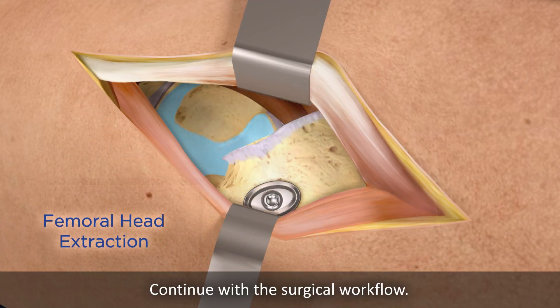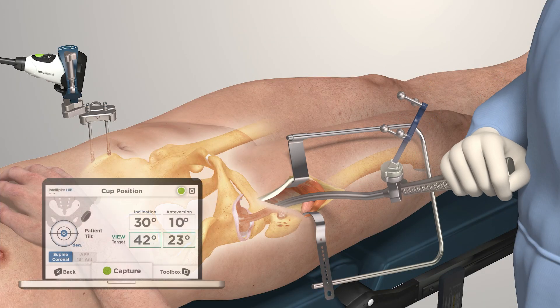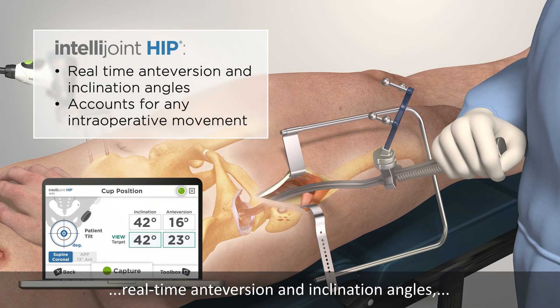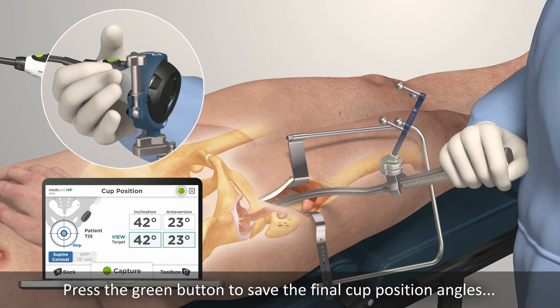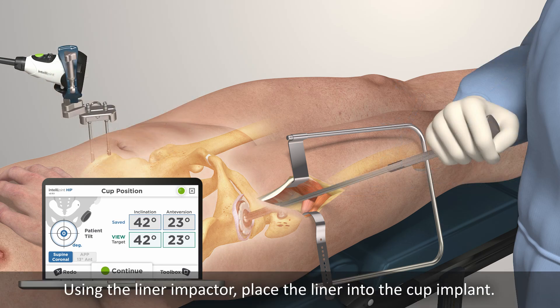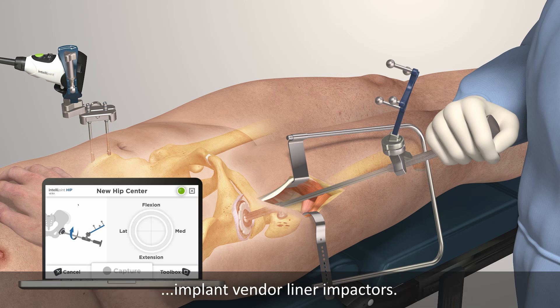Continue with the surgical workflow. The tracker can be easily attached to all traditional implant vendor impactors via a magnetic mount. Position the cup as desired. IntelliJoint Hip provides accurate real-time anteversion and inclination angles while accounting for any intraoperative patient movement. Press the green button to save the final cup position angles to a summary screen. Using the liner impactor, place the liner into the cup implant. Attach the tracker to the liner impactor using the magnetic mount. Pivot the impactor within the liner to register the new hip center of rotation.